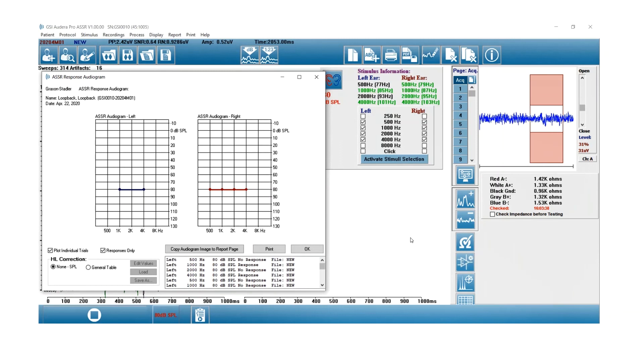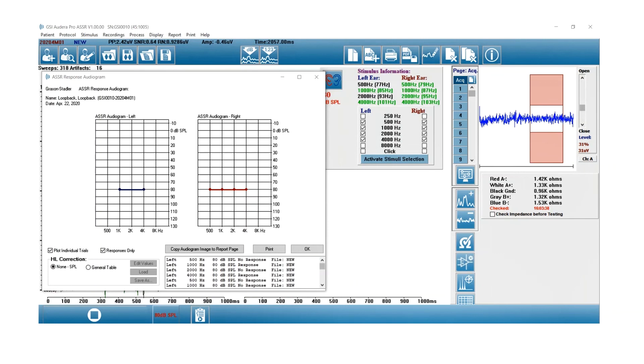I have two significant responses in the left ear at 1,000 and 4,000 hertz, and those are also plotted on my audiogram. I'm up to 318 sweeps before I paused the recording.